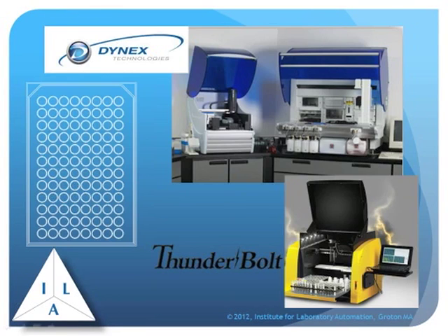One way of packaging these types of products occurs in life science examples. These are products from two different vendors doing an immunoassay analysis. When immunoassay analysis first began, you had a number of pieces of equipment set up for doing pipetting, washings, adding materials to it, possibly heating and aging the sample, and then making the readings.